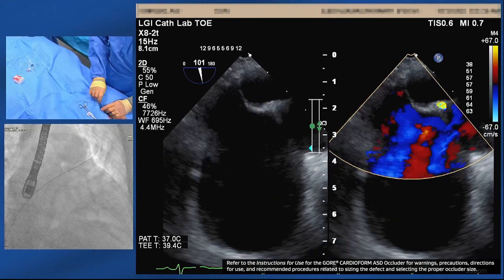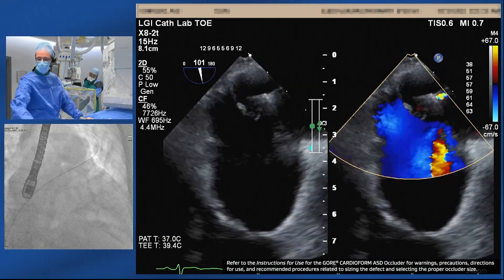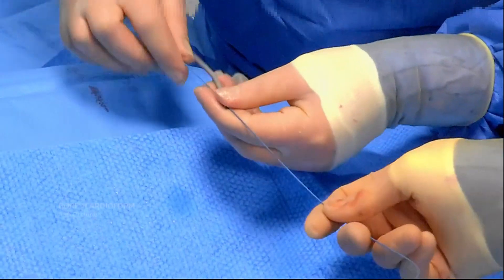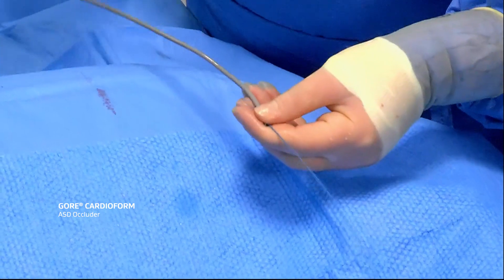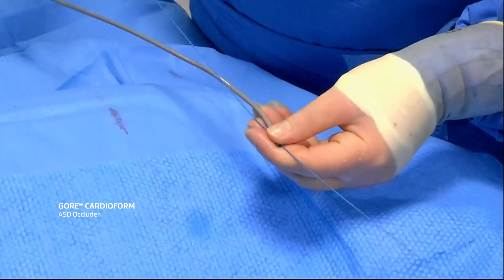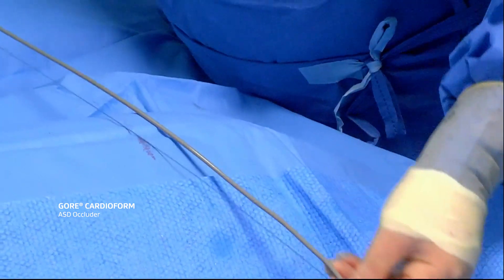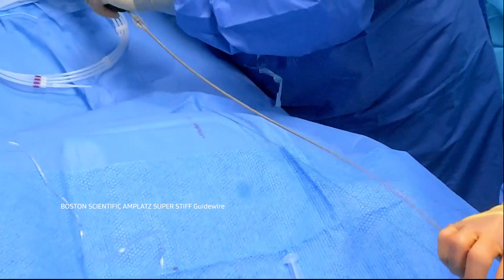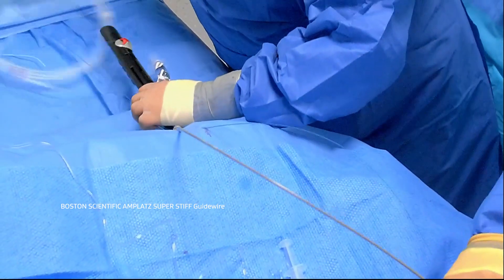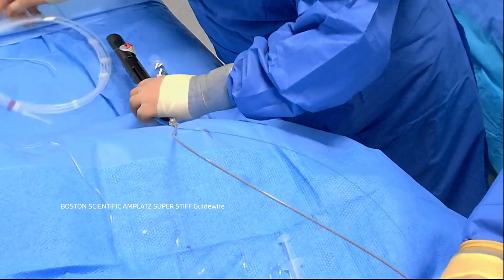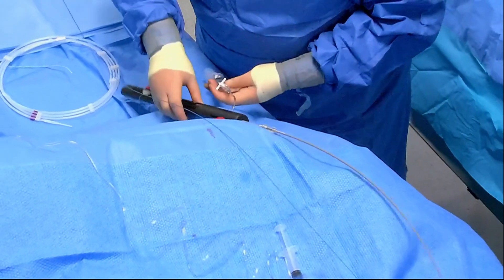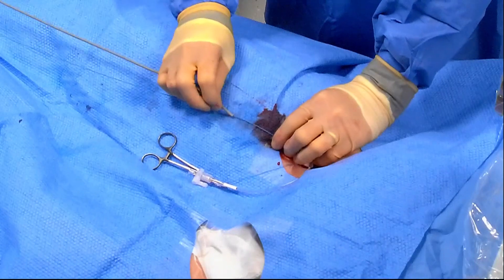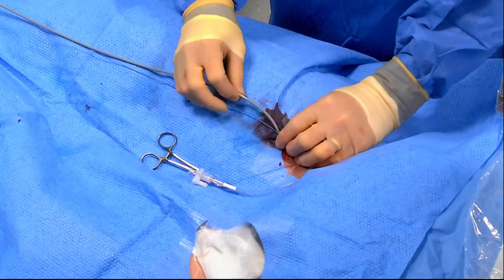We'll take a 37-millimeter device. We have a 37-millimeter Gore Cardiform ASD occluder loaded monorail onto a 35 Amplatz super stiff wire positioned in the left upper pulmonary vein. We'll flush as we go through. I've placed a 14-French sheath, so there's plenty of room.